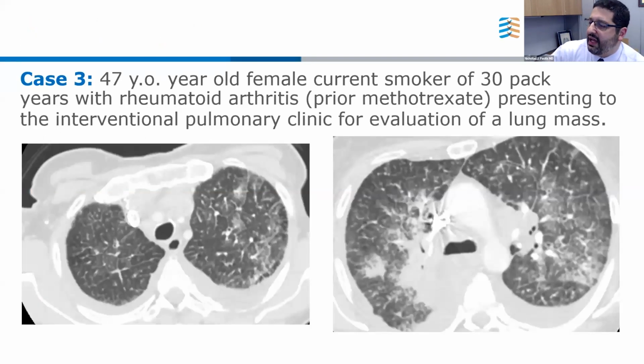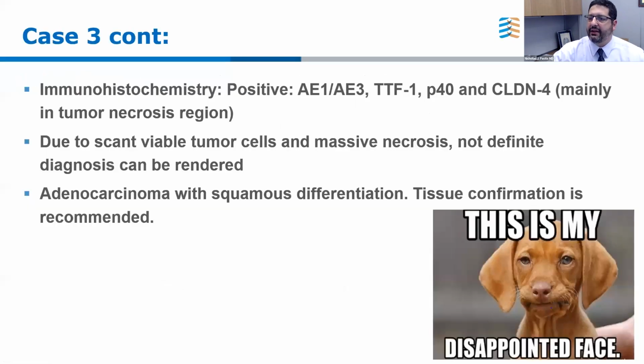And this is kind of a classic case that puts all those things together. This is a 47-year-old woman, heavy smoker, has a history of rheumatoid arthritis, and she presents with respiratory insufficiency, hypoxemia. And you can look at her CT, and you're already very suspicious of cancer. You see interlobular septal thickening. You see some small pleural effusions. You see a big hilar mass, adenopathy, multistation. So you already think, oh, this ought to be pretty easy to diagnose.